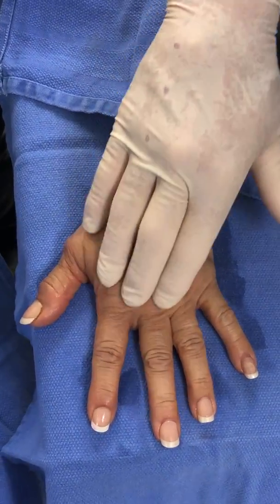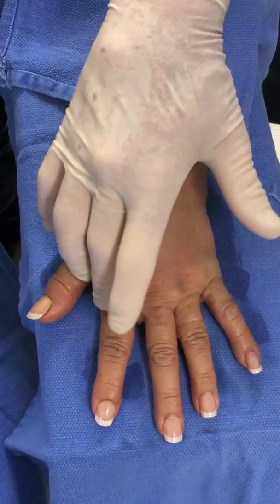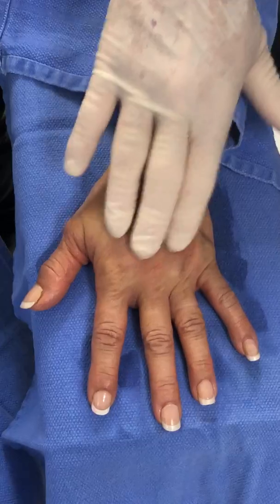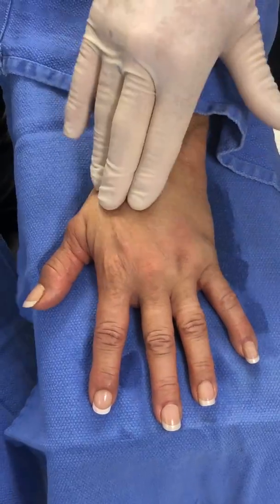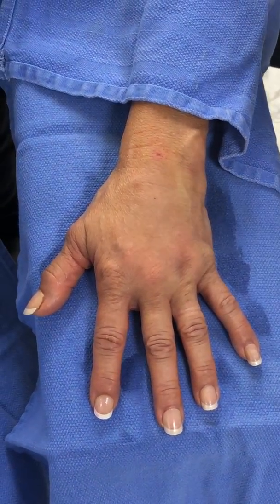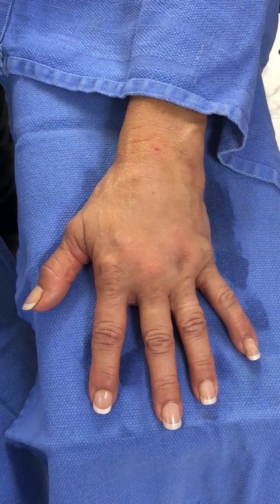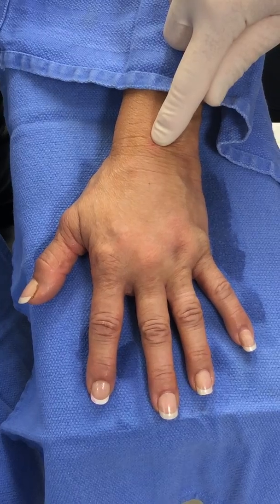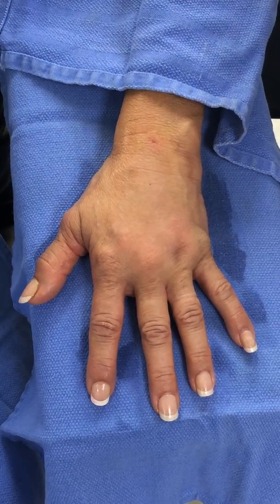We've distributed this — it's over the knuckle pads, which will actually rejuvenate the skin, and between the tendons. I'm confident that it's everywhere I want it to be. We'll put a Telfa Island dressing with some Aquaphor ointment and she'll be ready to go.